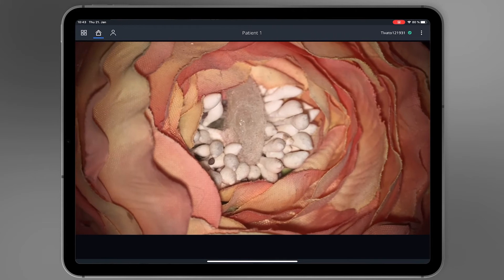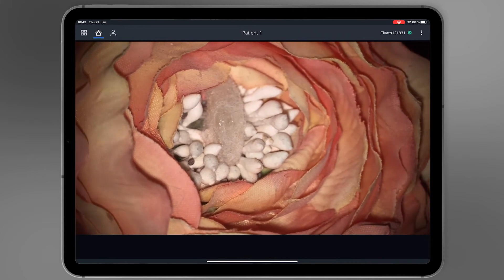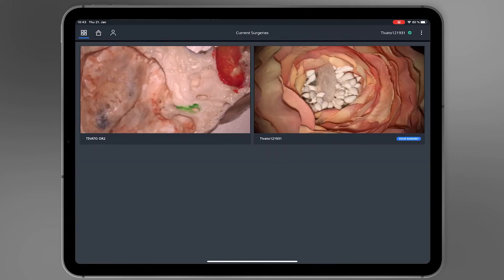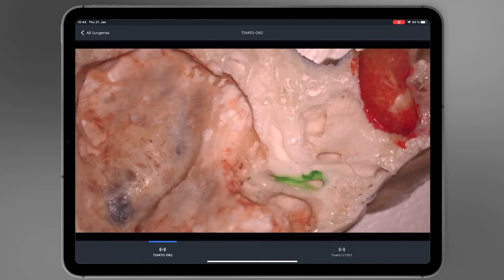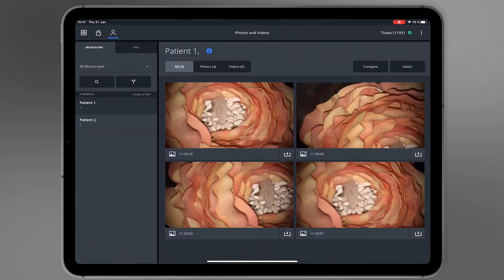If more than one system is connected to the network, touch the Current Surgeries tab to see the live streams from all connected devices. To see patient information, tap on the Photo and Video tab.